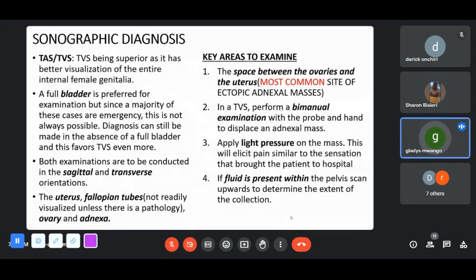And then what was the other? And of course, before all this, I am assuming that one has talked to the patient, gotten consent, and proceeded on to do the TVS in as aseptic a way as possible, right? So what else was the other challenge that you got? The other challenge I got was identifying the ovaries in the adnexa.